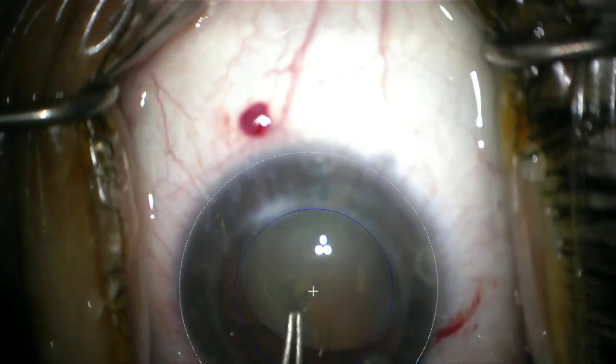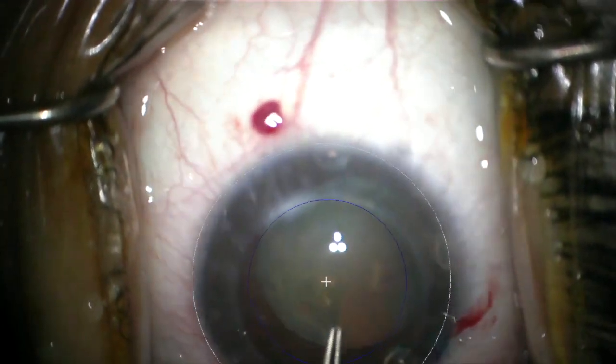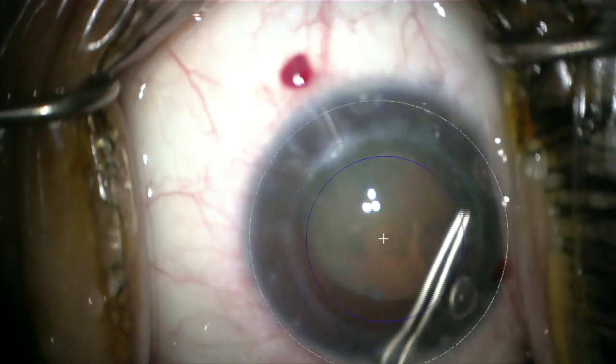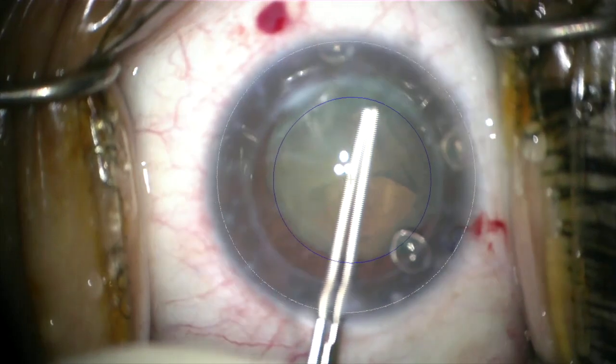You can see here that the optics of the graft-host junction can sometimes make the construction of your rhexis somewhat deceiving. And so I find that following along with the projection can aid in this.